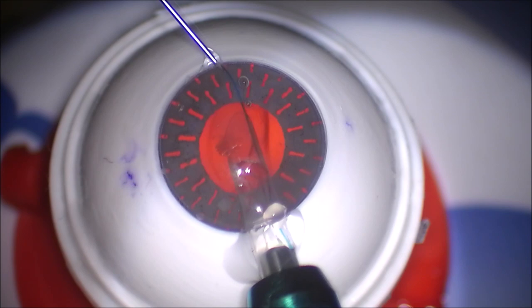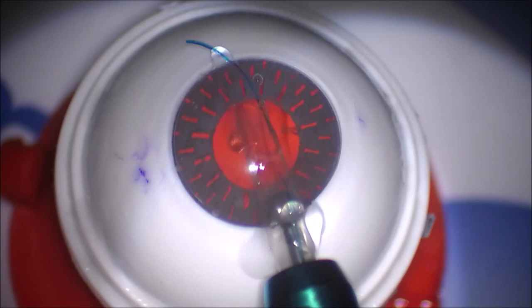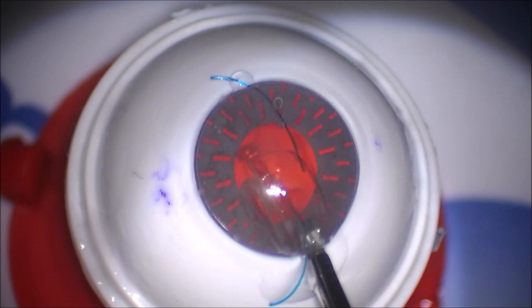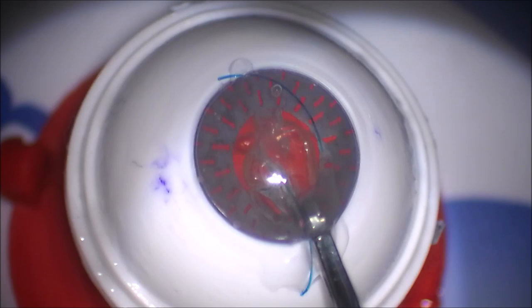I take over and I start to deliver the optic. Make sure the optic comes out in the proper orientation. In this case, I'm getting caught up in the incision. That's the only issue with the model eye. Sometimes you might get engaged, or maybe I just did a bad job in loading my lens. You're going to see something funny here. You can see the top actually came off the eye.